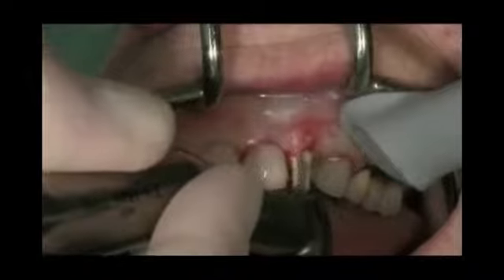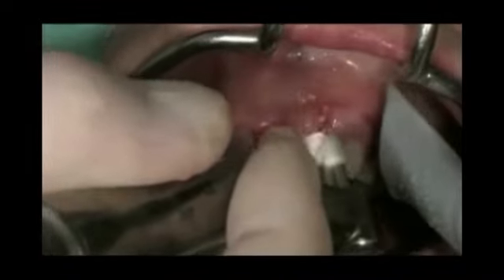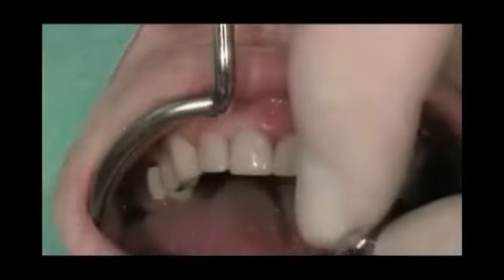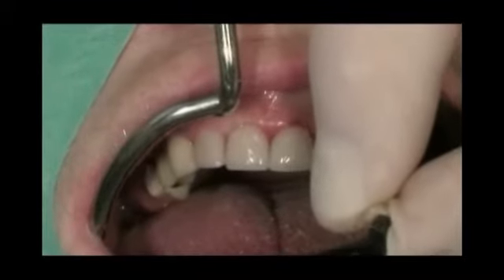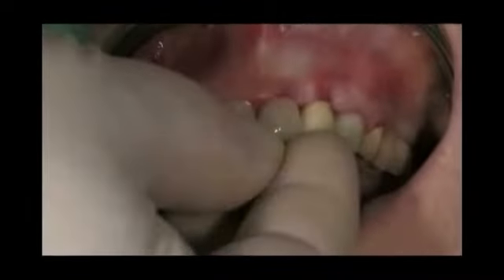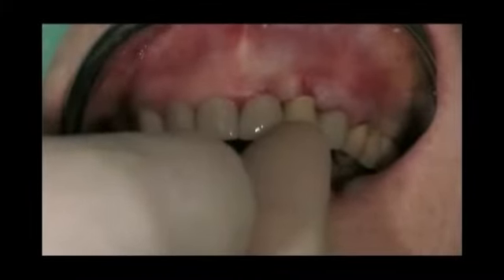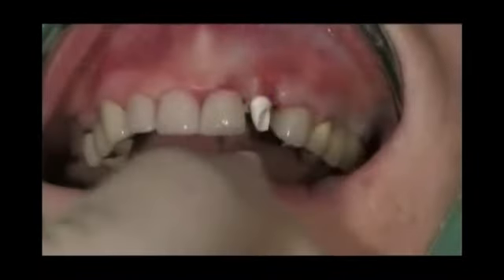A high-speed diamond burr and a white stone were used to finish and polish the post. A prefabricated crown shell was tried in on the prepared post and filled with composite resin in a matching color. An optimal emergence profile was developed within the provisional restoration. The crown was removed, contoured, polished, and cemented with temporary cement. Care was taken to prevent the material from entering the flap by not overfilling the provisional crown. No bonding was done, so the provisional crown could be easily removed.